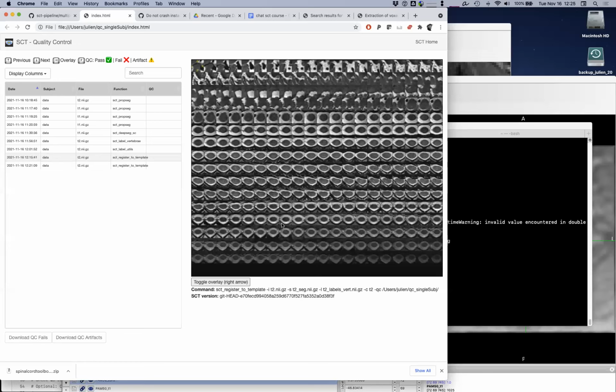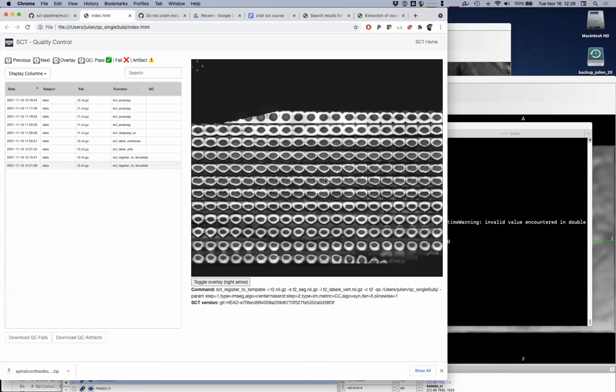If we want to extract values within the white matter tracts on this image, then this is going to affect the results. Will it affect it a lot? It depends. If you're only focusing on the location where the registration is very different, on only like 5 slices, then results would be very different.